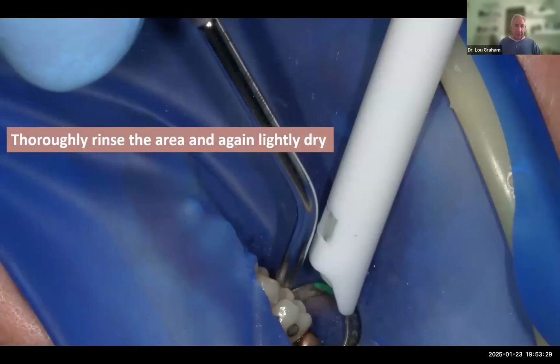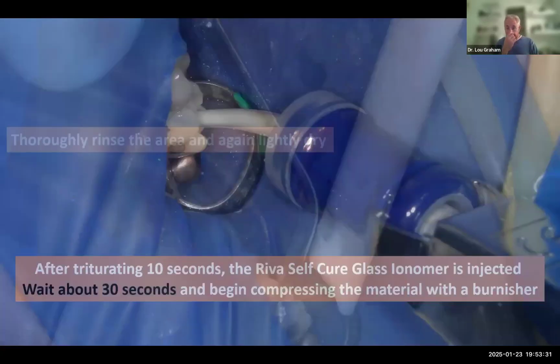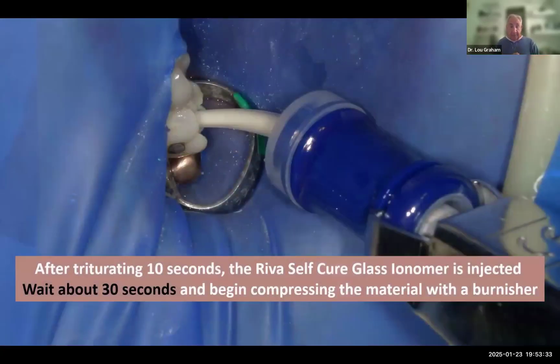So after I've thoroughly rinsed and dried the area, I'm now going to triturate the Riva Self-Cure after I pushed down and activated it. So again, I've already SDF'd. Now I'm placing my Riva Self-Cure glass ionomer directly over the area that we've cleansed.